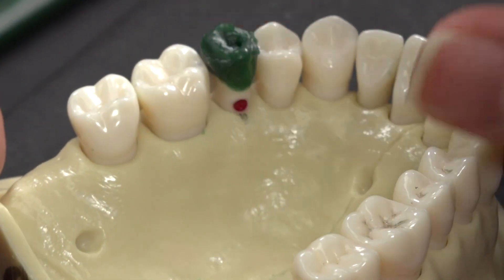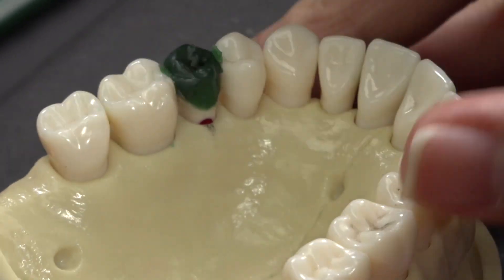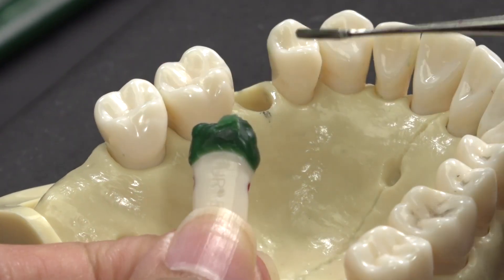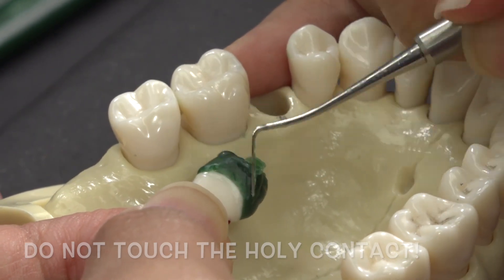When you place the tooth back into the typodont, you can see where the margins are overbuilt. This is good because the indentions will tell you exactly where the contact is. Now all you need to do is shave up to the contact and create a smooth interproximal.